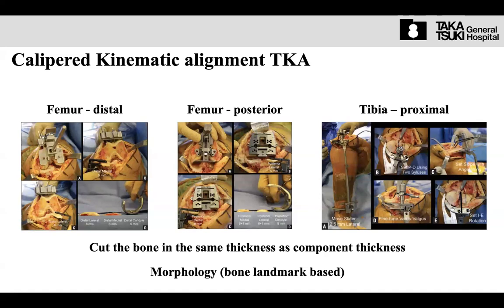If we use the medial side worn or kinematic paddle, we call it worn and unworn. Worn means one side is 2 millimeter thicker, compensating for the cartilage wear, and the unworn side has no compensation. So there is a 2 millimeter difference. Then put it on and cut.